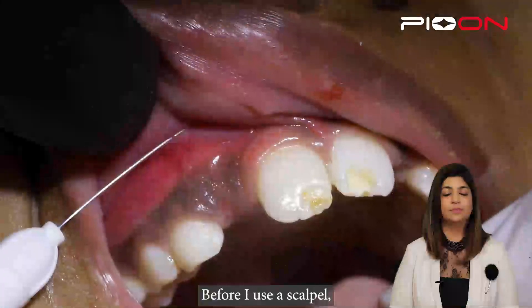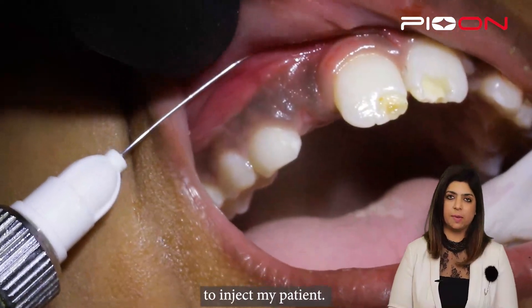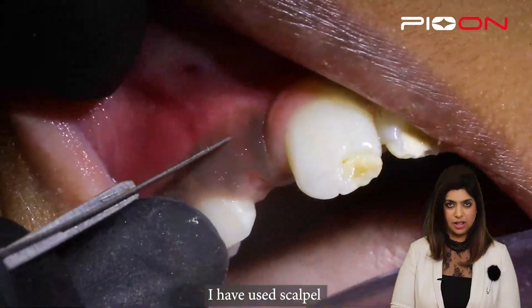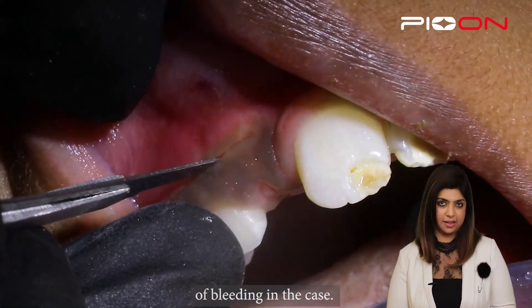So let's start with the scalpel. Before I use a scalpel it is very important to inject my patient. I've injected my patient, I've used my scalpel and exposed it. You can see the amount of bleeding in the case.